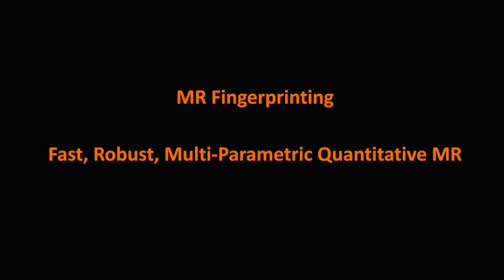Fast means that we hope this scan can be applied in clinical settings and implemented in the currently very busy clinical workflow. Robust means that we hope this scan can be applied across vendors at different sites, providing consistent results, and can also be applied to image different parts of the body.